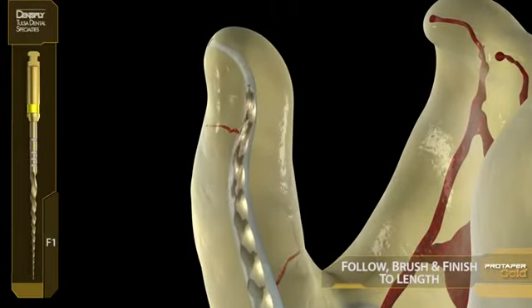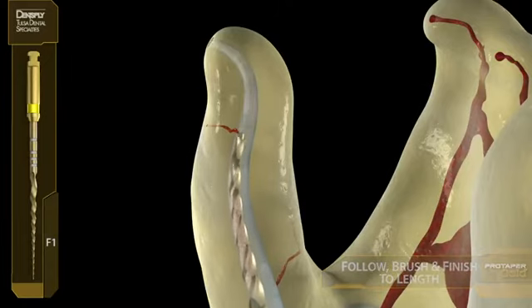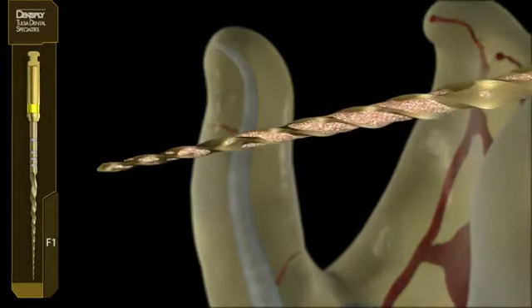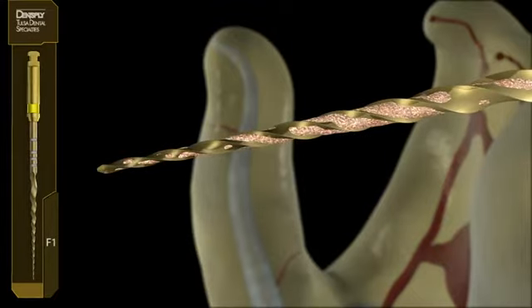In animation, you can see the flutes are not full yet of dentin. And when we inspect the flutes outside of the tooth, we can see that we would have had false tugback, because that shape does not yet exist. So this is our cue to progress with F2.